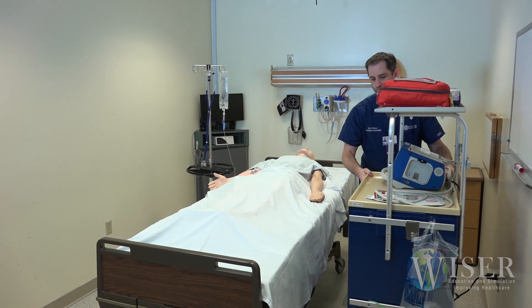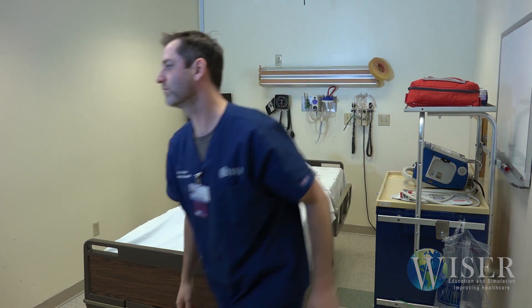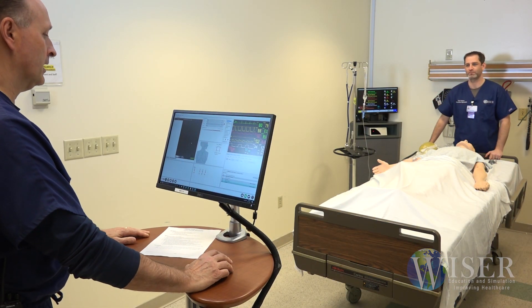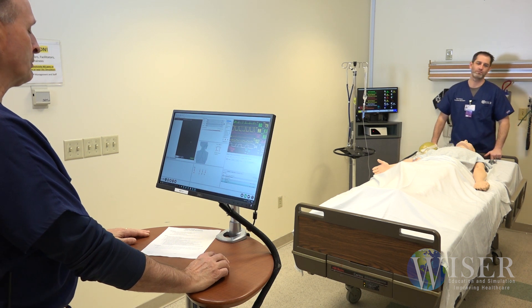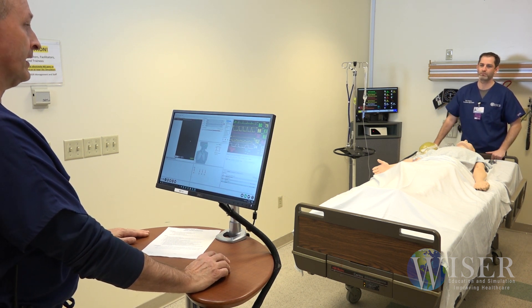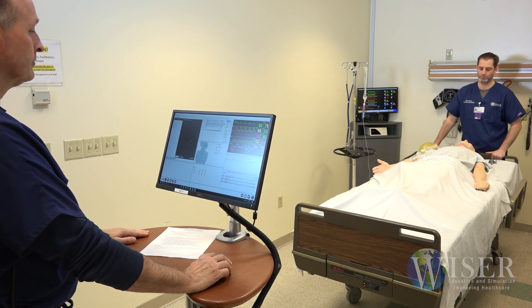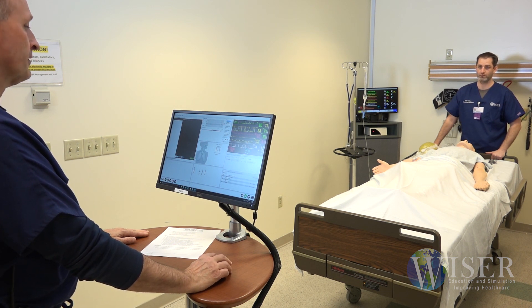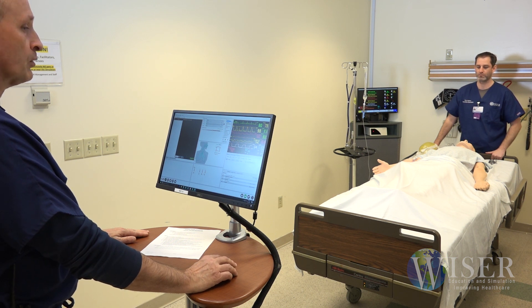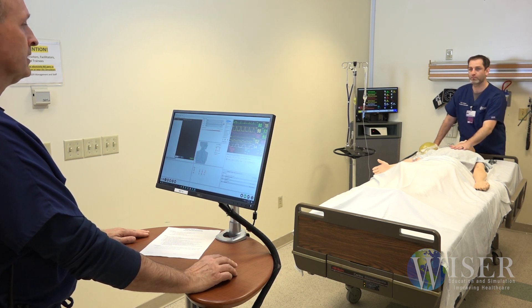Once everything is set up, SimMan needs to be tested to make sure everything is working properly. After completion of the room setup, we then test the simulation software and the mannequin to ensure proper functionality. One of the first steps is to ensure that the mannequin is breathing, so I will confirm with my partner that the mannequin is breathing.